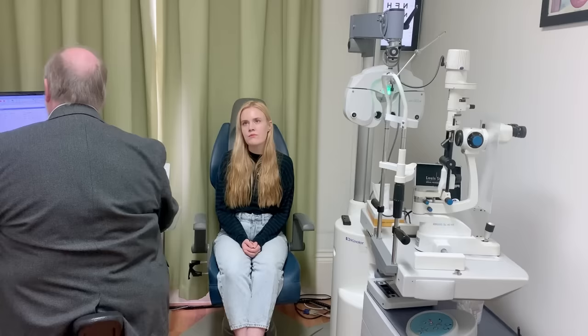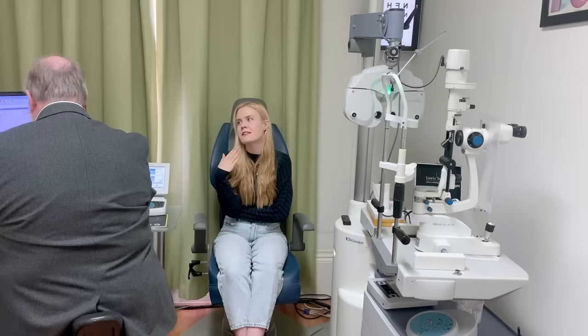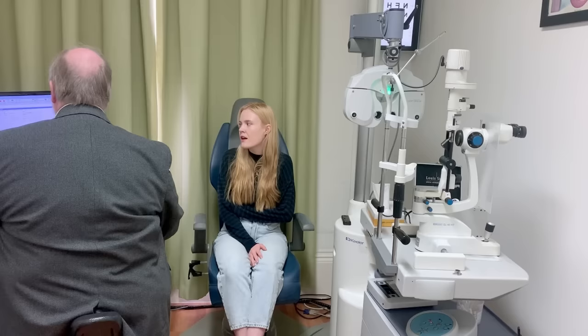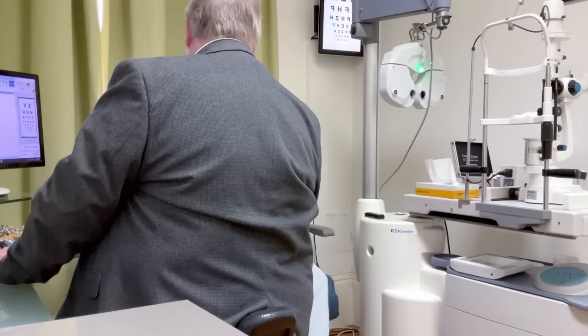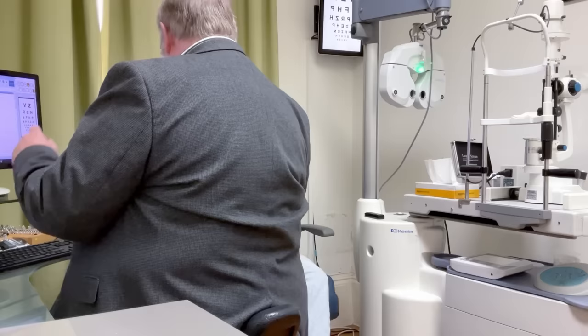Mainly, 4 or 5 p.m., nearing the end of my work day when I just want to take a break but can't because of work. Yeah. And how often do you get those? Recently, it's a lot better when I am actually wearing my glasses. Okay. So that helps, doesn't it? Yeah. So sometimes it's me just not wearing them all the time when I should. Enough. Yeah. Right. Anything in the vision? Any floaty, dotty bits? Any flashy, lighty bits? No. Okay. Great stuff.